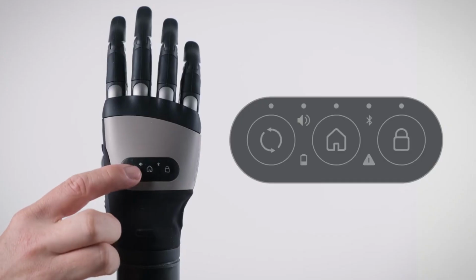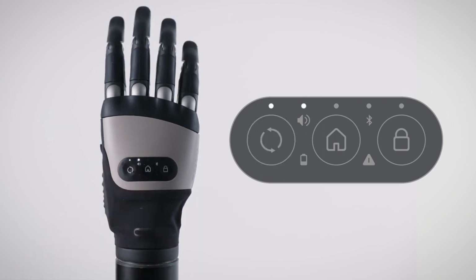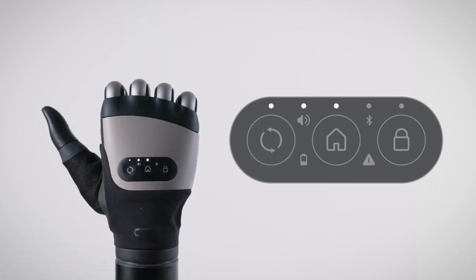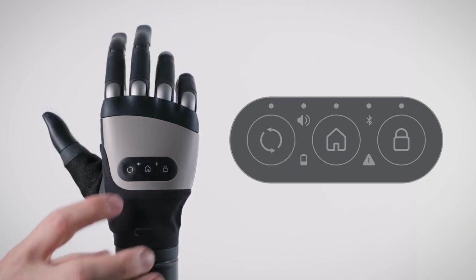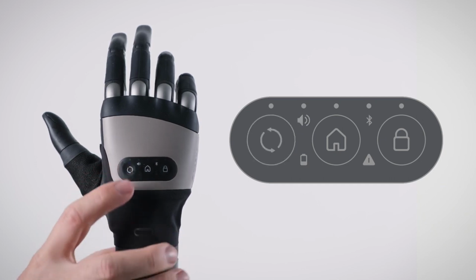A short press on the cycle button will cycle through the 3 default grips: the flexi tool, the tripod, and the key grip. And a long press will turn the audio on or off again.